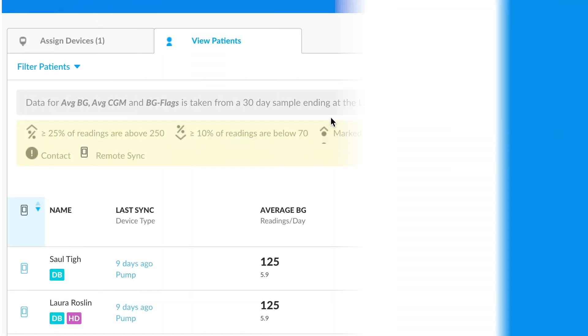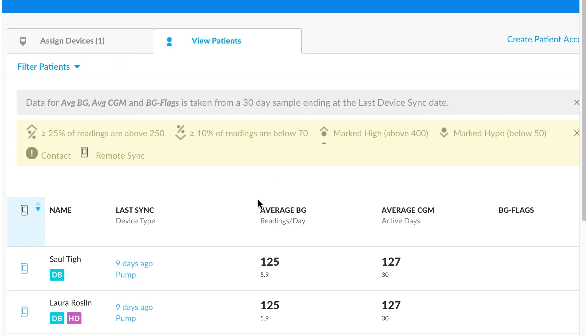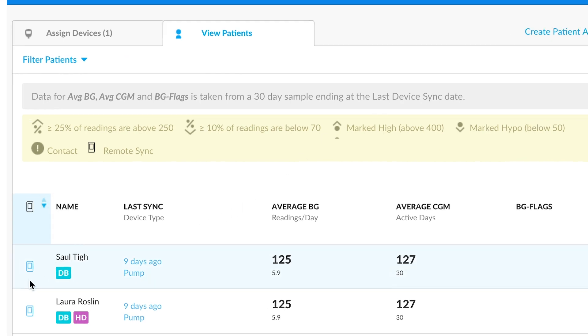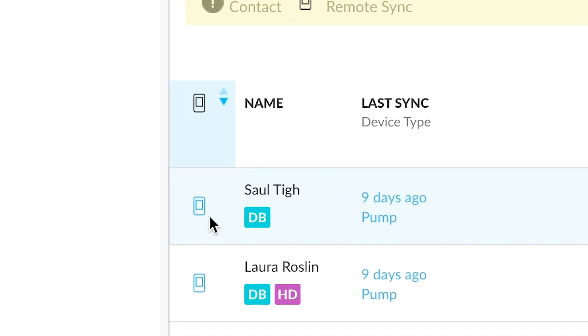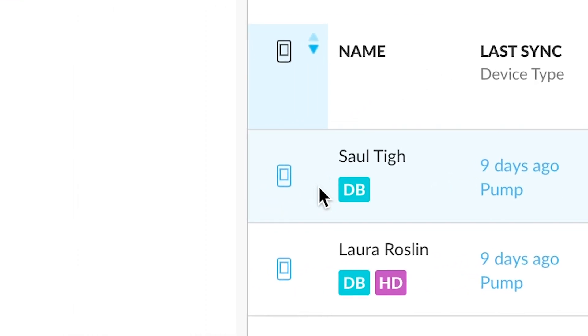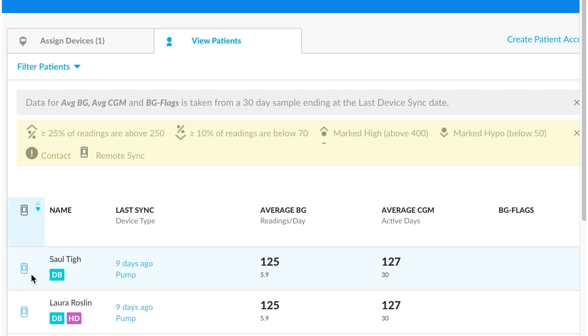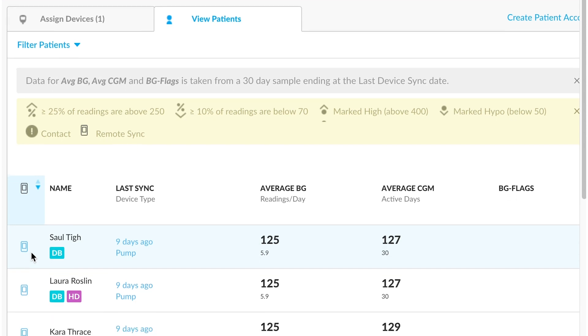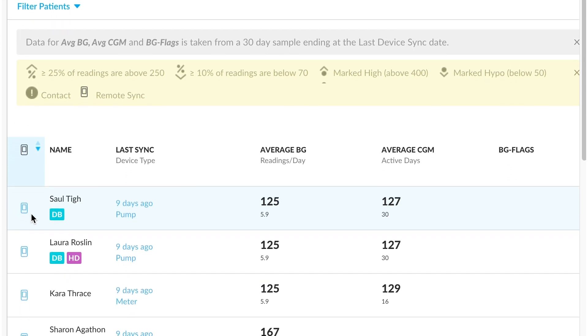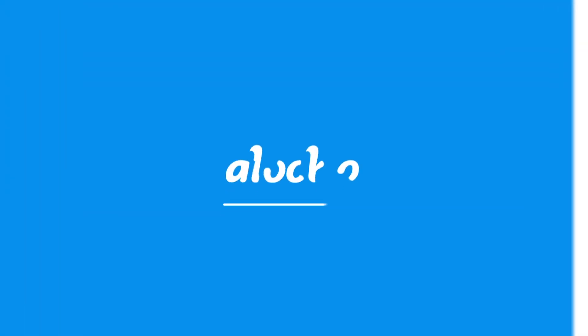If you see a blue phone icon to the left of a patient, for instance, right here, it would indicate that there has been remote data that's been uploaded to this patient's account. That can either happen through a patient manually uploading a device or even through one of our APIs, like if a Dexcom account is connected and that data has been pulled into the patient account for you.